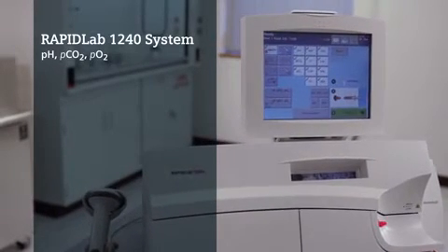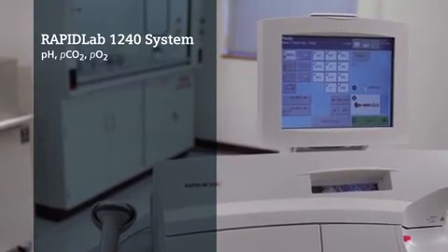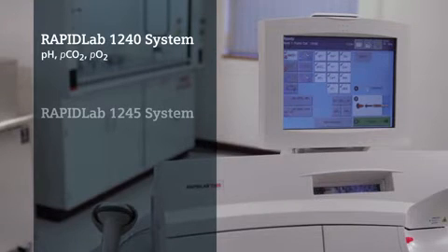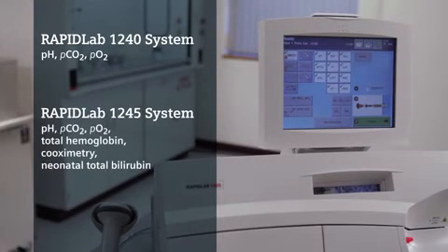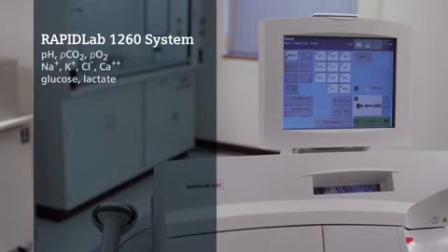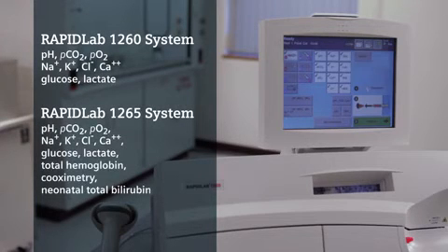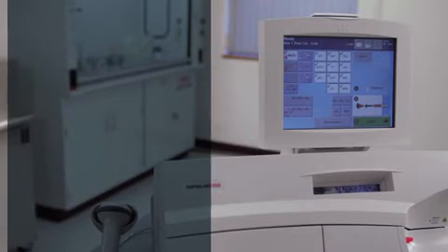There are four different models of the RapidLab 1200 systems, depending on the analytes tested. The RapidLab 1240 and 1245 systems for basic blood gas and co-ops. The RapidLab 1260 and 1265 systems add electrolytes and metabolites to the menu. All use the reliable, long-lasting ReadySensor electrode technology, which require little to no maintenance.